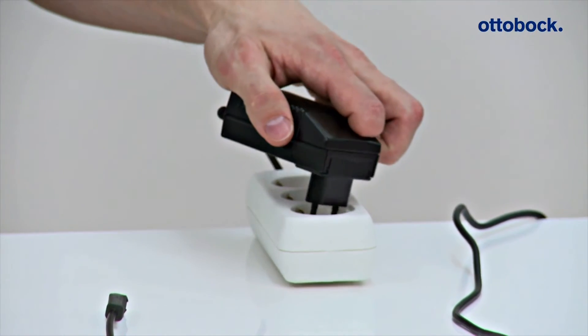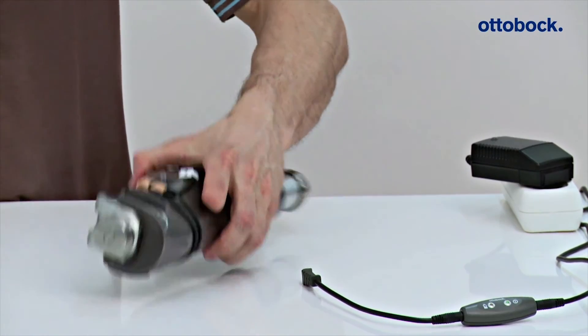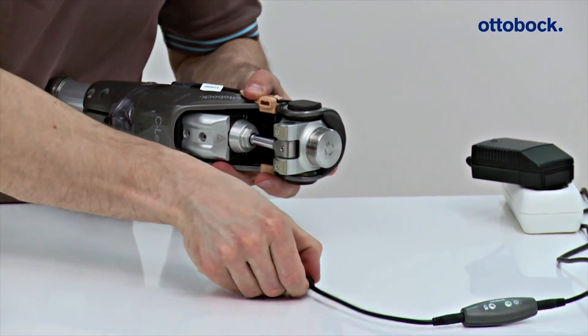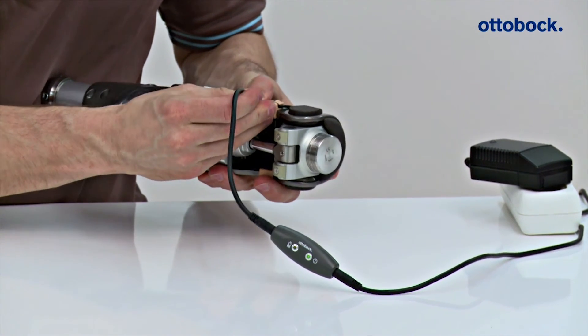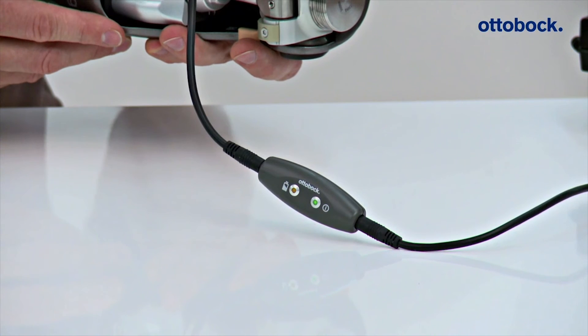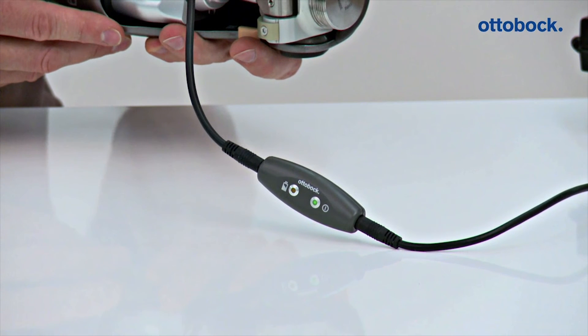Following installation of the charger extension cable, the O&P Professional also checks the charging function of the knee joint. After connecting the charger, the knee joint emits a beep signal and shortly after that a 3x vibration signal. If there are no feedback signals, the joint is not charged. In this case, check if the charger was connected correctly.